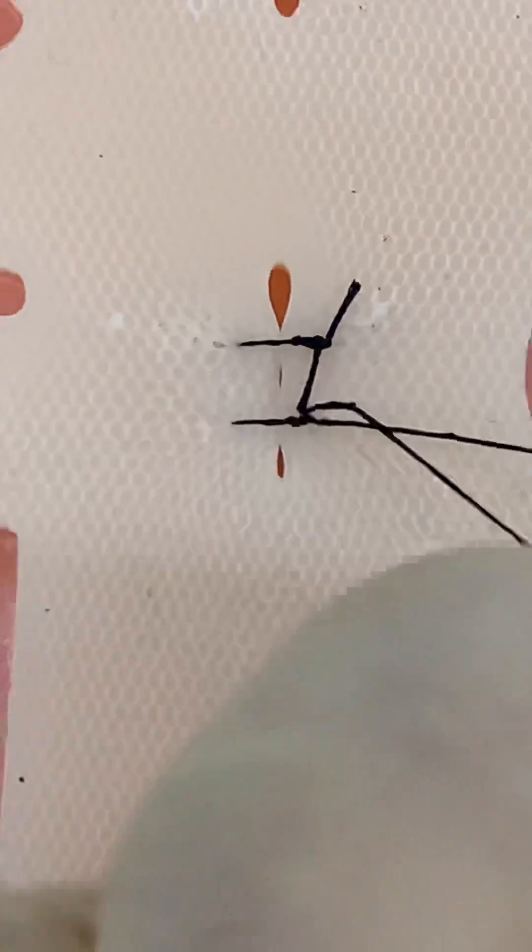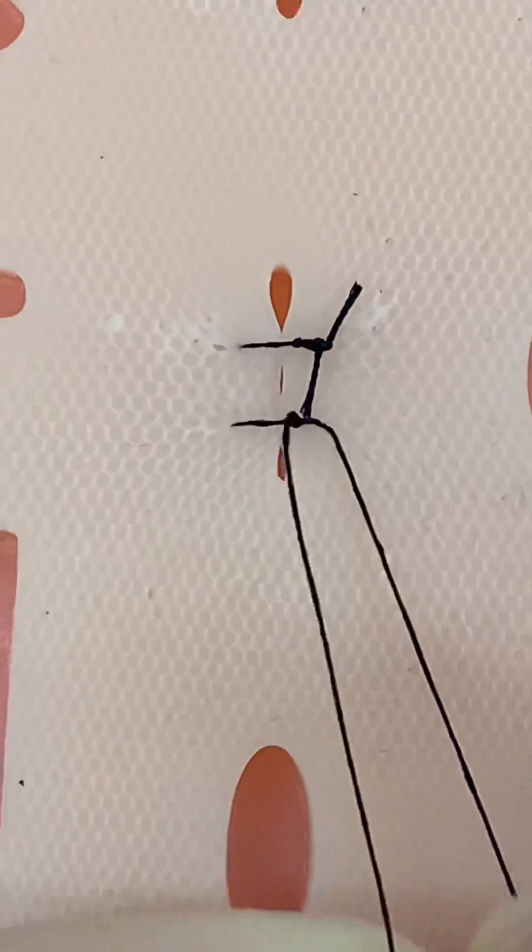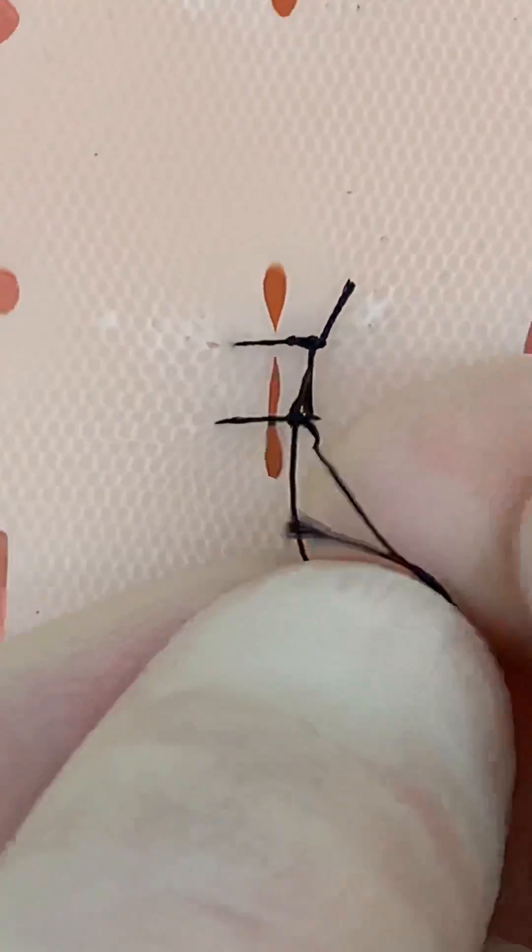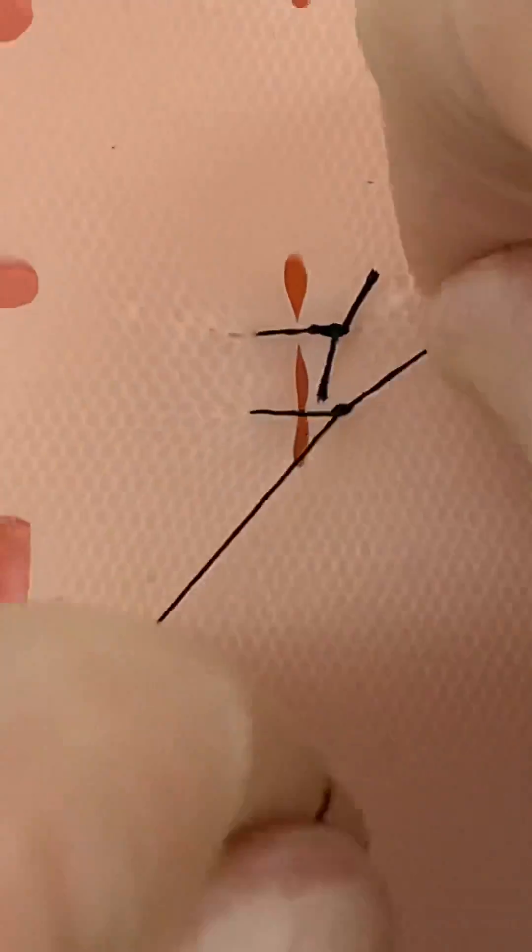For example, if I pull the right strand over and under the first time, I'll need to pull it under then over the second time because, if I forget, I'll need to take everything out and start again.